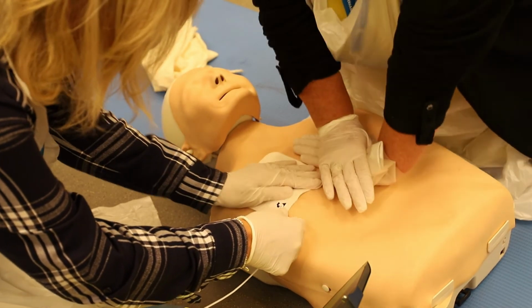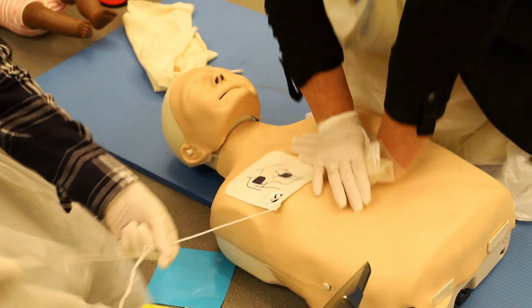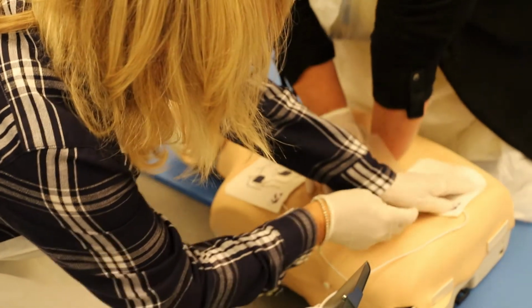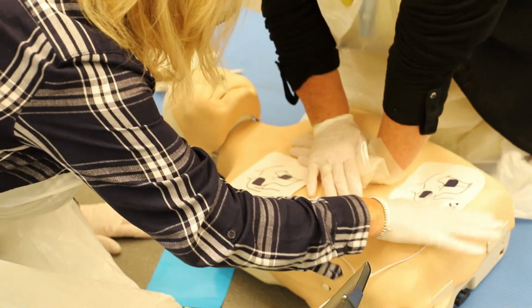Place one pad on bare upper chest. Peel second pad and place on bare lower chest as shown.